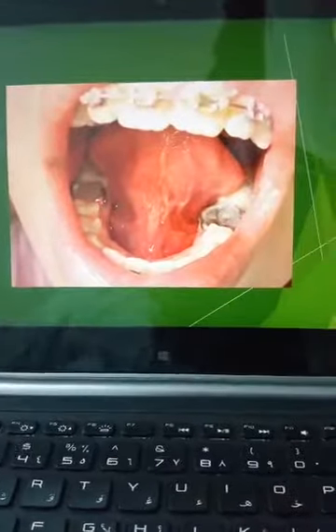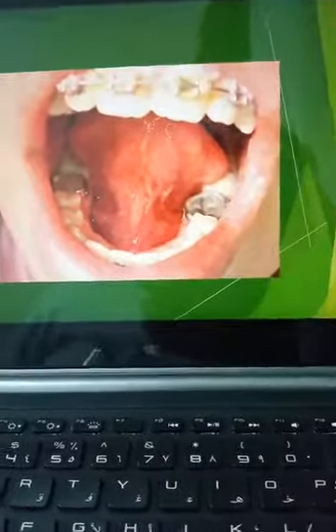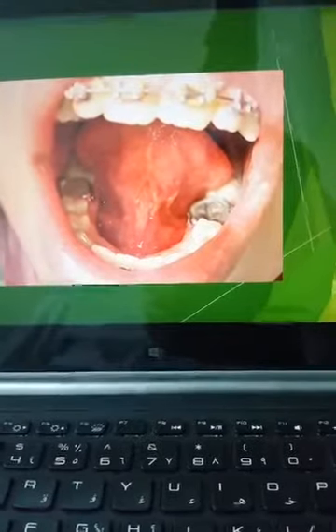Here, in the floor of the mouth, we have the lingual frenum, and other structures are the salivary gland ducts, where it is not actually direct, but you have to be careful. You have to consider it in your mind when you're applying the laser here. If you are using CO2 laser, you have to be careful not to touch the teeth because it's harmful to the hard tissue. In this case, you cover the teeth with gauze.